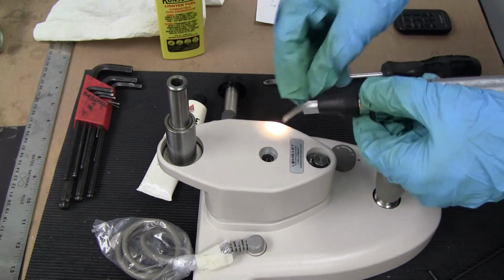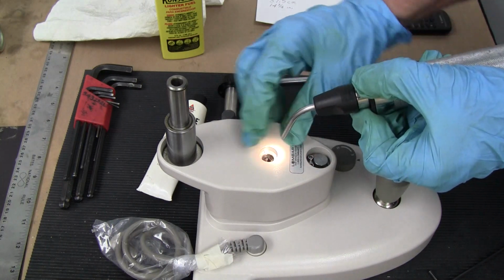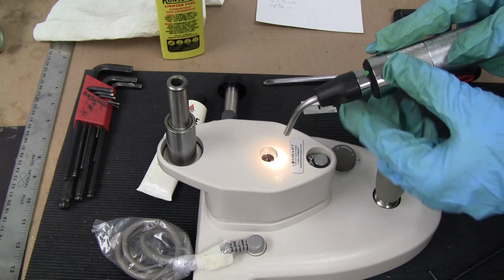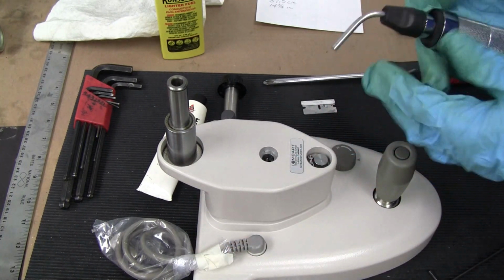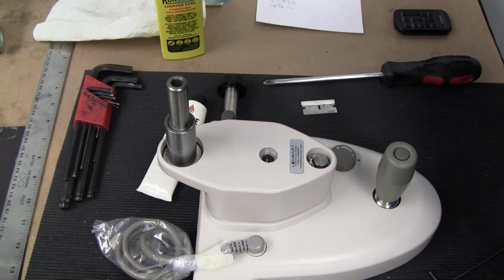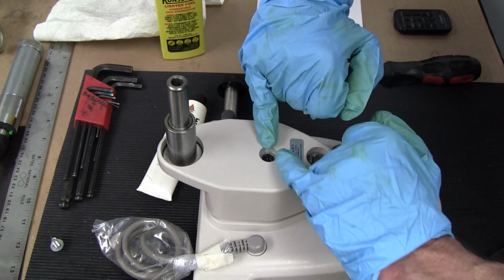When you put it back together, you'll know, because there's a little key and a keyway on the shaft and on this lift arm on the bottom, on the casing. They need to match up and fit right in. So look at that, observe it, and make sure that yours is the same way. Sometimes if this was loose, that key might have gotten off, and it needs to be corrected. There's another video out there on correcting a wobble issue that will explain that whole issue further. So we looked at it, everything looks good.